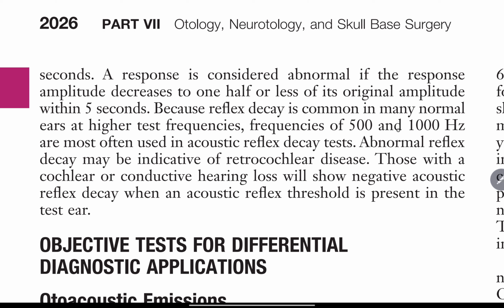frequencies, 500 and 1000 Hz are most often used in acoustic reflex decay tests. Abnormal reflex decay may be indicative of retrocochlear disease. Those with a cochlear or conductive hearing loss will show negative acoustic reflex decay when an acoustic reflex threshold is present in the test ear.